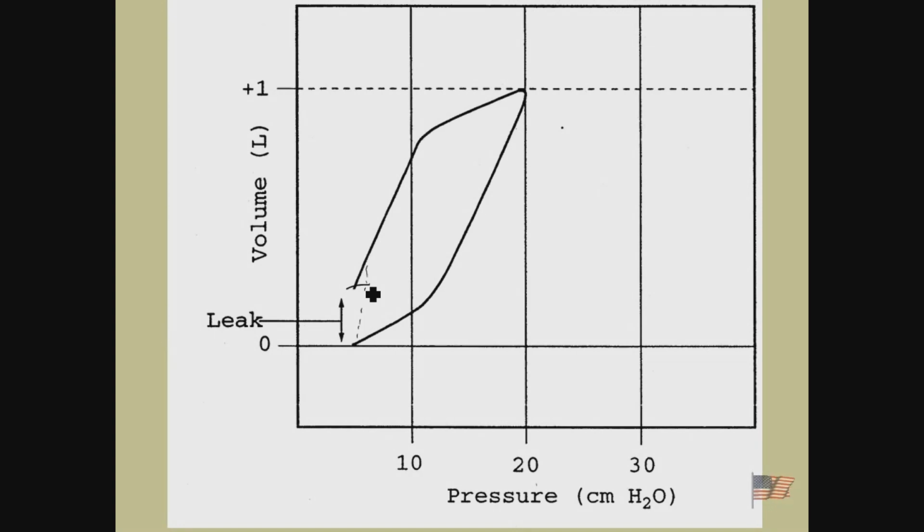This sounds stupid, but where is it leaking? Somewhere between the patient and the circuit, or somewhere between the ventilator and the expiratory valve. This inspiratory limb is what the ventilator is delivering. This is all on the patient end, so somewhere between the patient and the expiratory flow transducer, there's some volume being lost. Where? You've got to go and check all your connections. I've actually used a stethoscope to listen along the way and see where something isn't fitting. Could be the cuff.